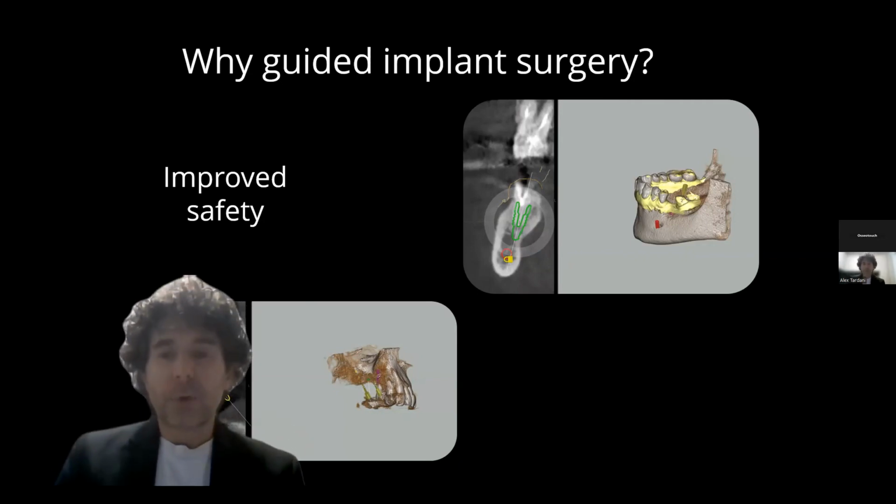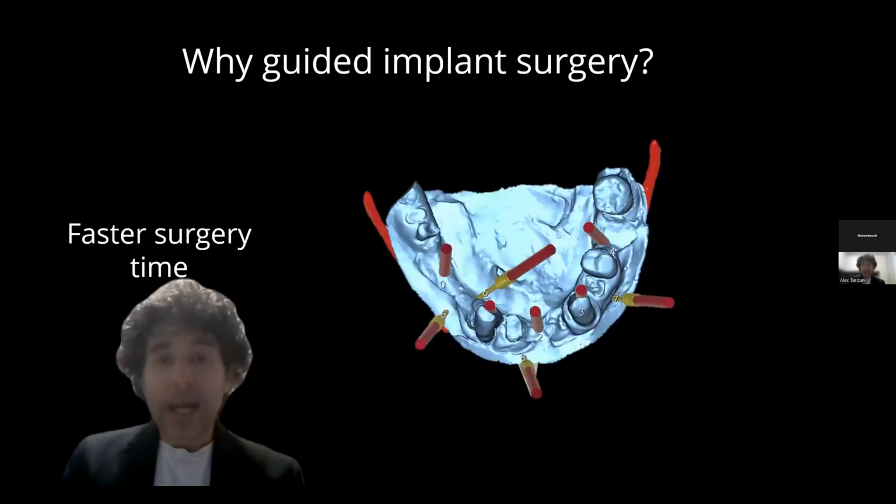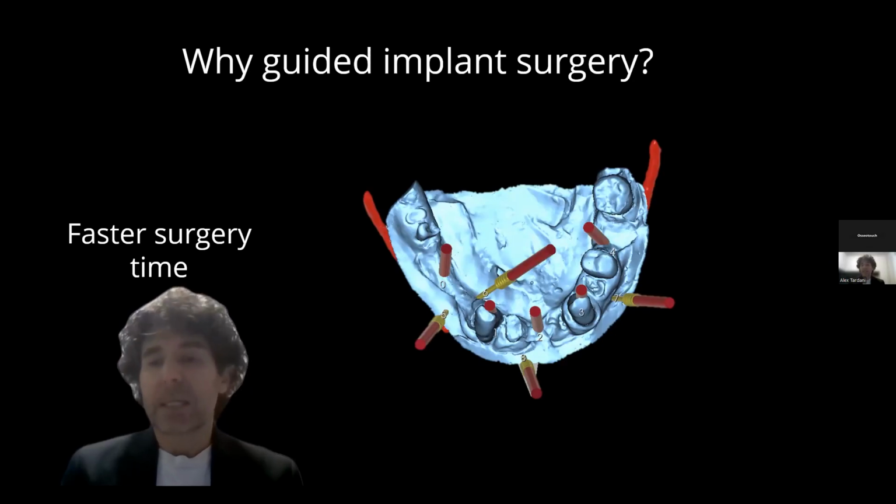Doing all this beforehand, calmly, and obviously without the stress of the immediate surgery will later lead us to perform a much faster procedure. Why? Because we've already performed the surgery when we were relaxed in front of our computer and without any anxiety. So it will just be a matter of replicating inside our patient's mouth what has already been done virtually.